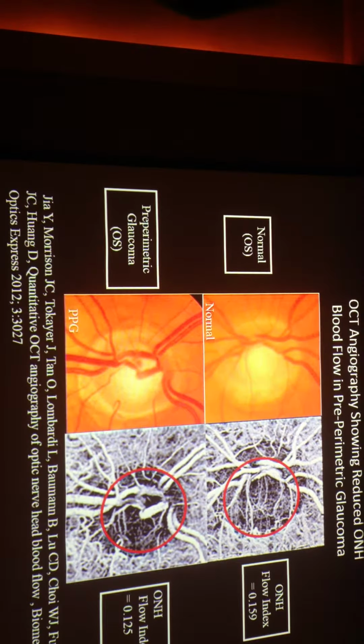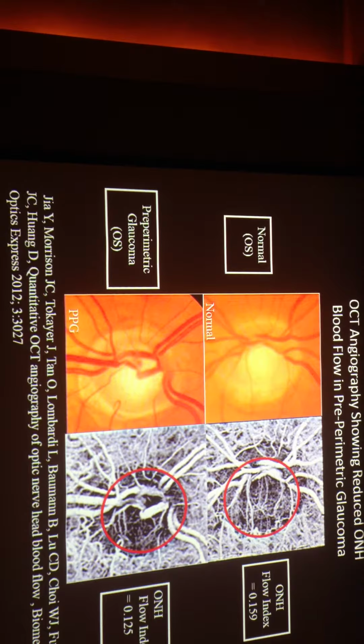The problem in this study was that we had just a morphological reference and a subjective analysis of these different zones of non-vascularization around the disc. And as we are working with Yali Jia and David Huang, they have developed in their labs with OptoVue a few indexes for observing the quantitative part of this alteration.